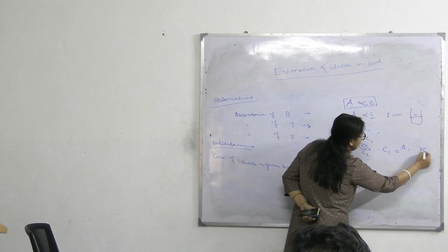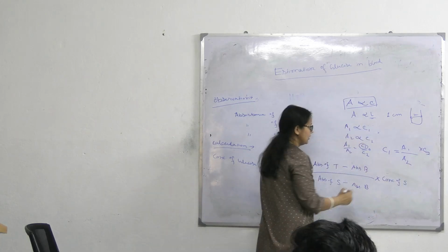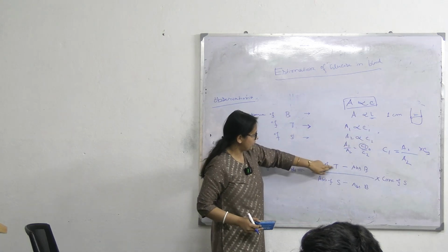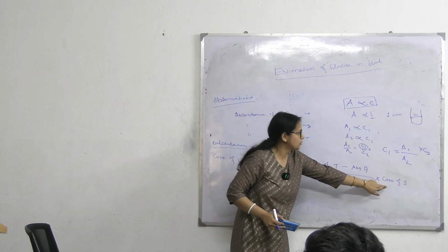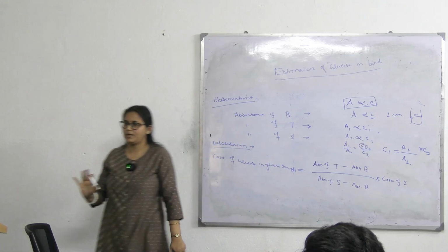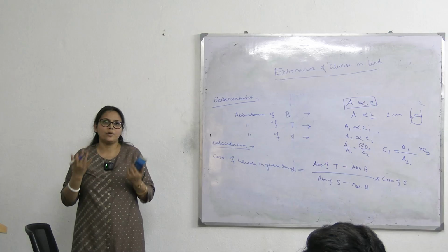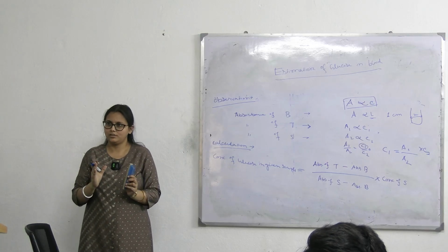A1 into C2 by A2, ঠিক আছে? এবার দেখ, this is the same absorbance of test, আর নিচে হলো absorbance of standard আর এখানে হলো concentration of standard, ঠিক আছে? এবার মাঝখানে এইটা কোথা থেকে এলো? ব্ল্যাঙ্কের, তাই তো? ব্ল্যাঙ্ক আমাদেরকে মাইনাস করতে হয়, কারণ there may be some impurities in reagent, or sometimes reagent can itself give color, so we have to minus it, ওকে?